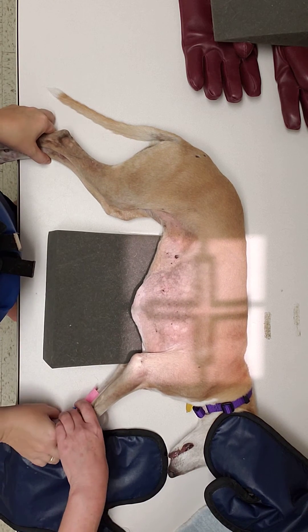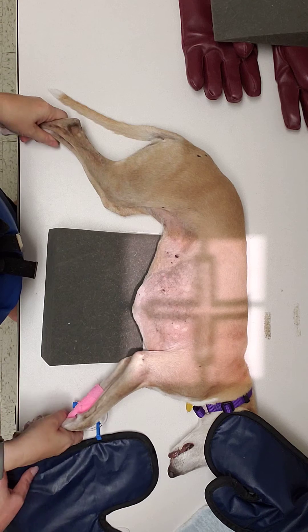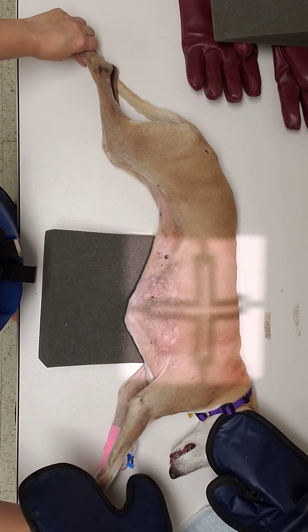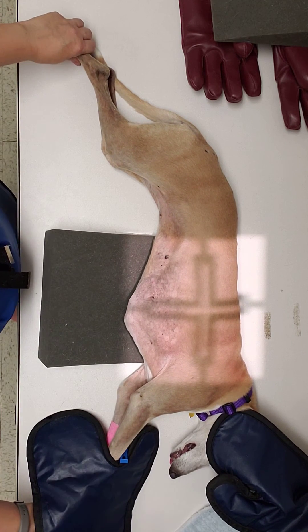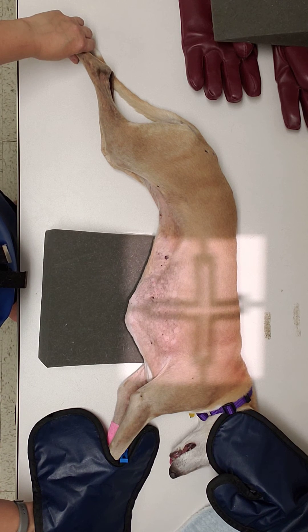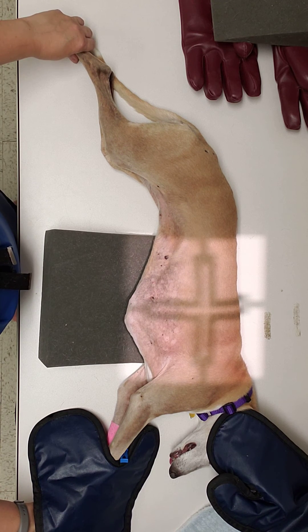When you take your radiograph, you want to make sure it's on full inspiration. You're going to pull her legs forward and backward depending on whether you're pulling front legs or back legs, and this is when you're going to snap your radiograph.